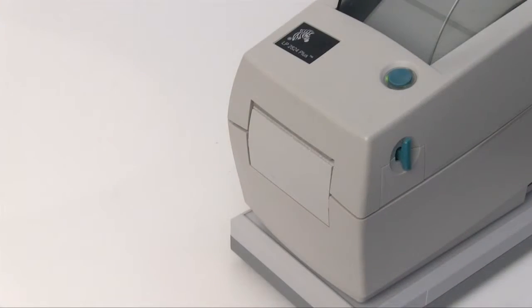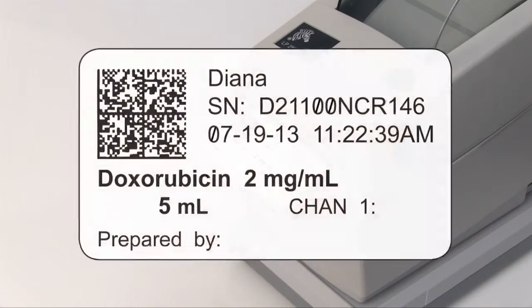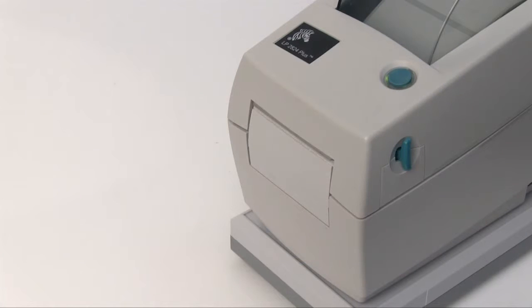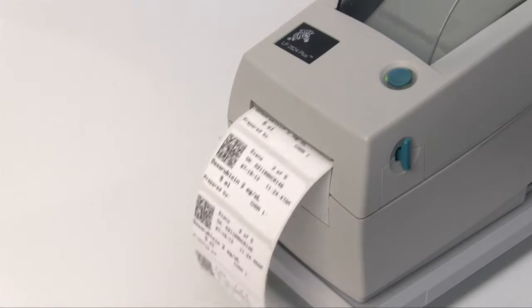After the mix is complete, Diana prints out a label containing the system's serial number along with the channel used, the drug name and concentration, and the volume, date, and time mixed. The label will also contain a barcode that corresponds to the patient order number that was scanned at the beginning of the process, as well as a place for the technician to sign indicating that the mix has been completed as ordered. Depending on your workflow, you can program Diana to print up to five separate labels for traceability.